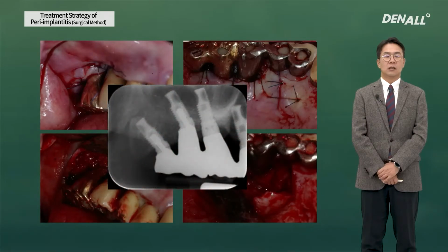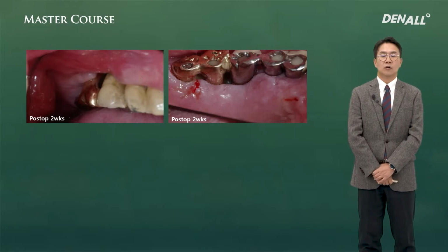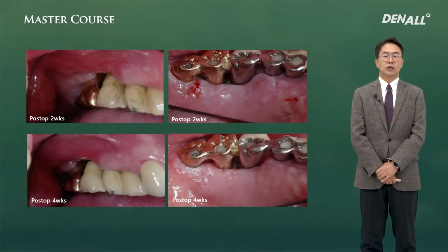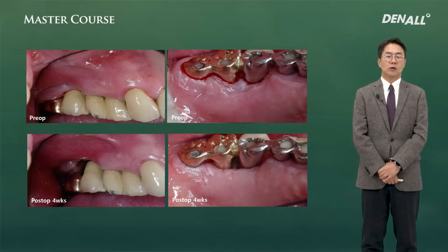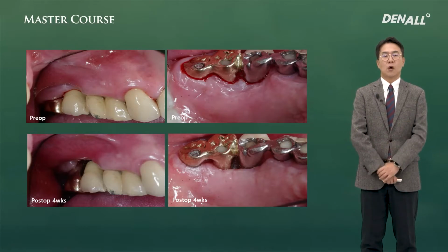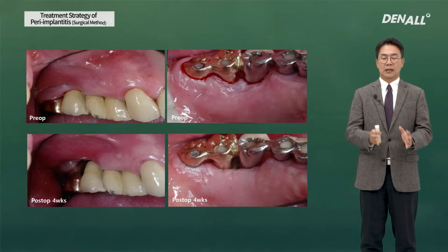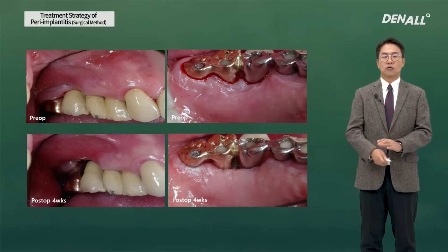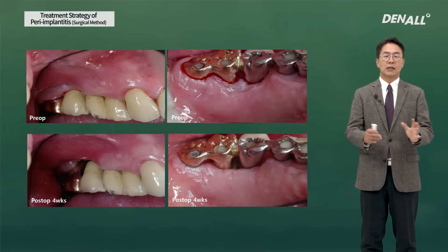Now, bone graft is now made possible. It's now fully open. As it heals, I made a path where an interdental brush can be used. Compared with the initial visit, you can see that in some cases, embrasures have disappeared. As you have seen earlier, I did non-surgical therapy, and as swelling died down, this appeared, and after surgical treatment, it was expanded.